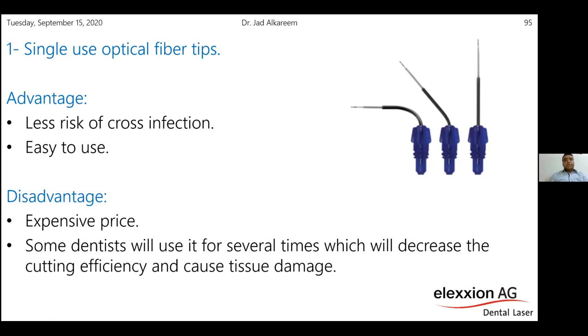Sometimes some dentists will try to autoclave them or sterilize them, but this is not recommended, because when sterilizing these kinds of fibers, they will become damaged and brittle. And when you use them in the patient's mouth, they will simply break and they will not transfer the correct energy. So you have to use these fibers only one time, as recommended by the laser manufacturer.